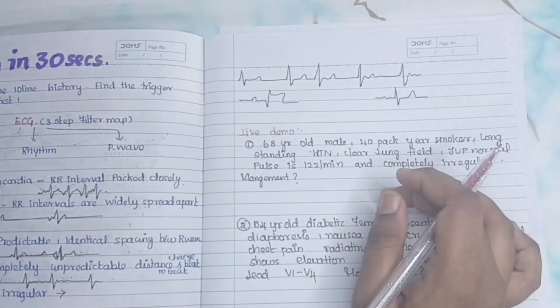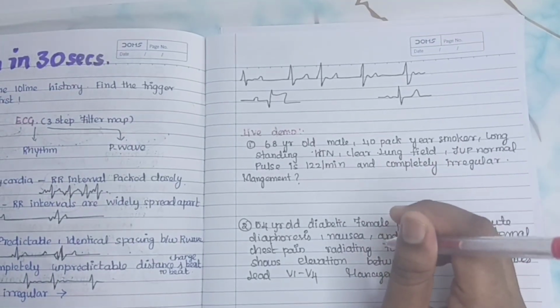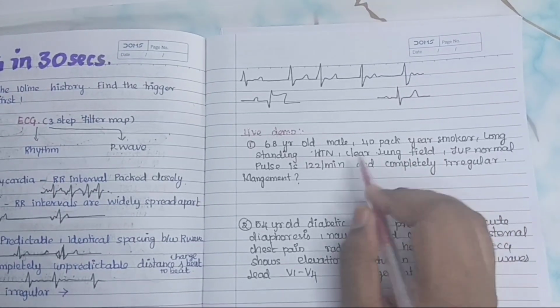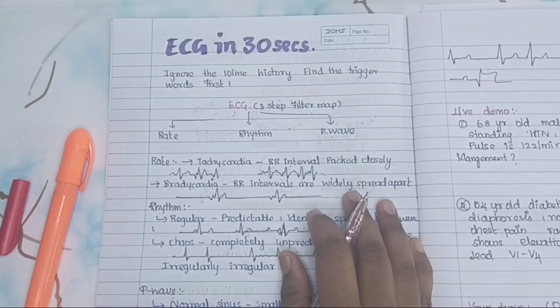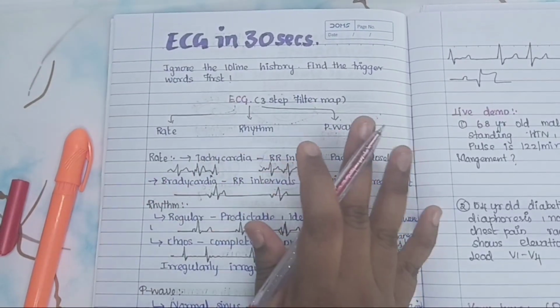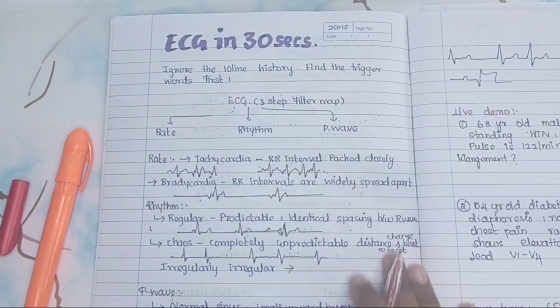Today we are going to completely reverse engineer the NEET PG ECG question. By the end of this short video, you won't need to be a cardiologist to lock these marks. You just need to follow 3 simple paper filters. Let's break it down. Whenever you see an ECG on the exam paper, completely ignore the complex 12 leads first. Go straight to the paper strip and ask these 3 exact questions in this specific order.